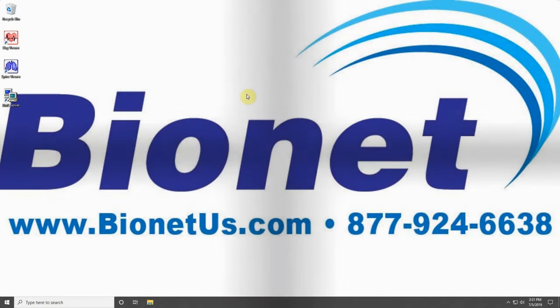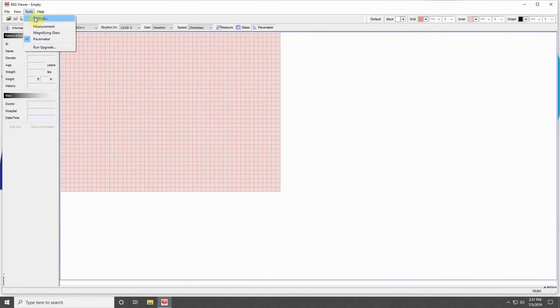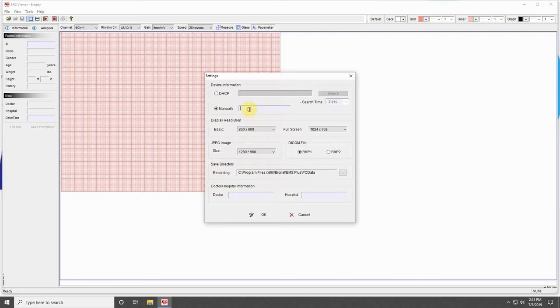With a successful ping, return to your computer and open the EKG Viewer program. Click on Tools at the top, and then click on Settings. Click on Manually, and input your machine's IP address that you wrote down earlier. Now your computer has your machine's IP address, and your machine has your computer's IP address, which allows them to communicate.